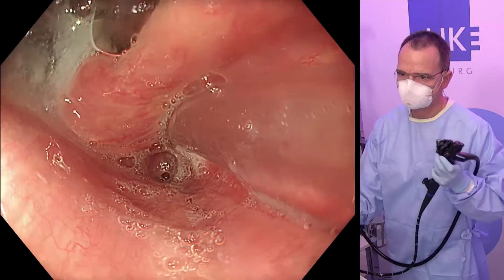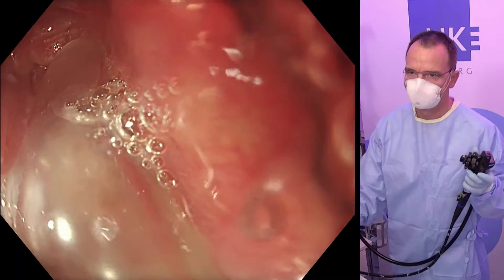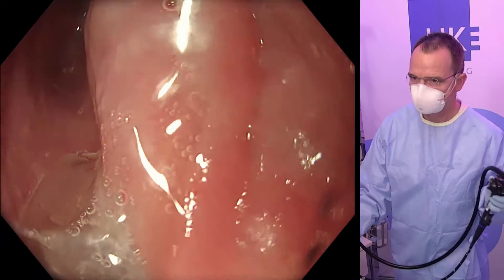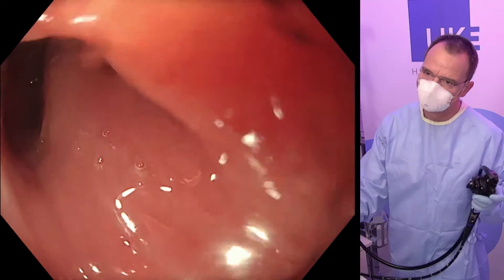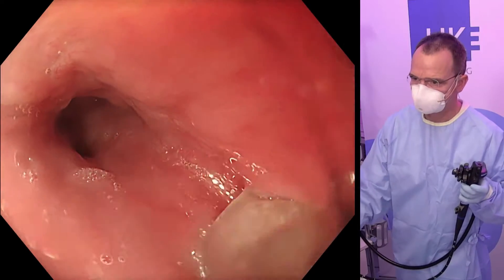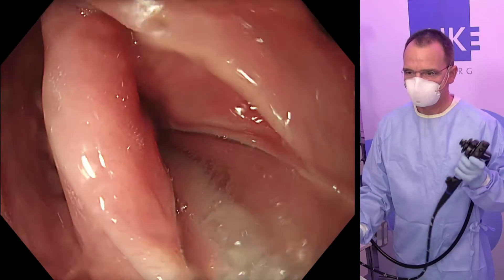This is the tube which has to be redirected and finally enters the esophagus. It usually ends up in the diverticulum but can be redirected with the help of the endoscope. As you can see here, the endoscope pushes the tube aside, and here the tube is coming and getting into the right direction in the esophagus.